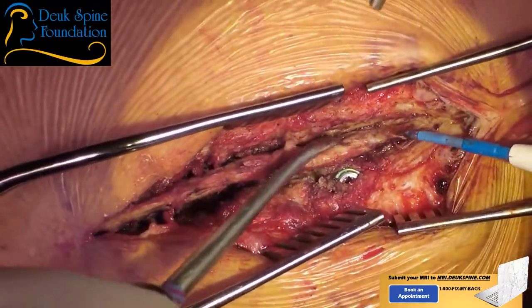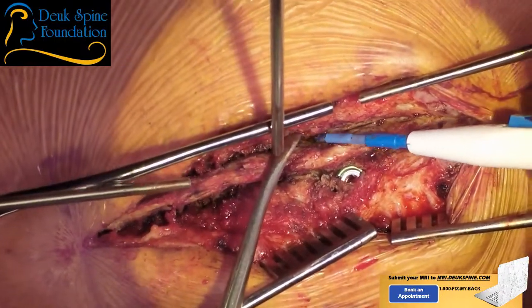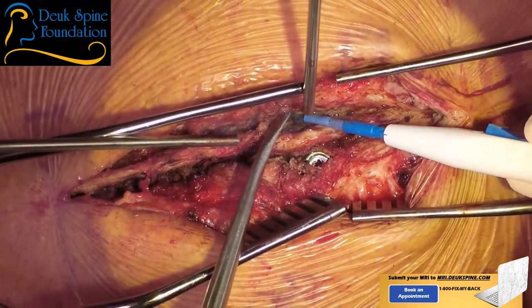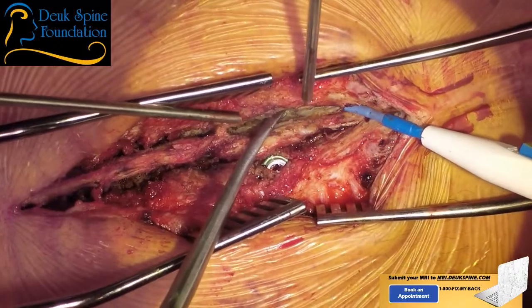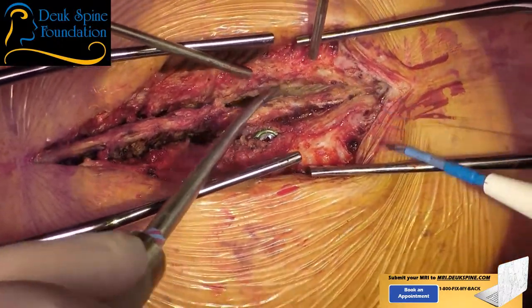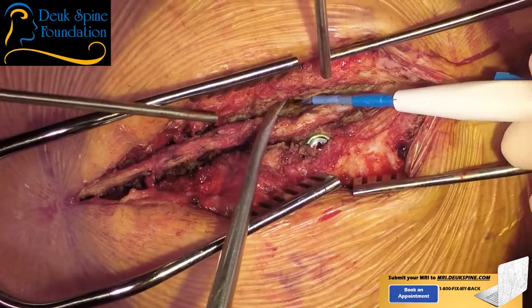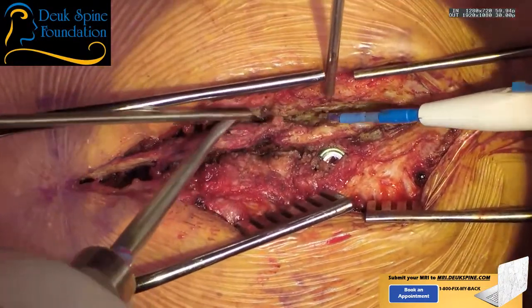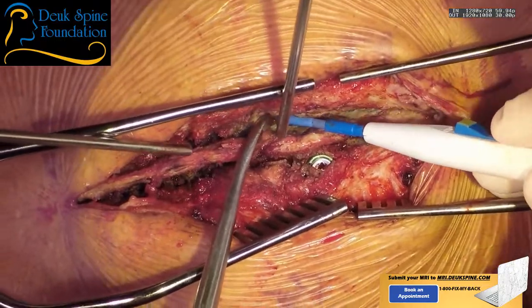So what I want to do is basically get us lateral enough to do what's called a laminectomy, but we're not fusing. I don't want to have to fuse up here. I just want to decompress. Now, I talked to the patient at length before surgery, and we talked that maybe he will need a fusion at some point, you know? But for right now, he doesn't need a fusion up here. He just needs a decompression because he's getting his nerves pinched very badly. And so my goal is a decompression. It's not stabilization. It's not reconstruction.